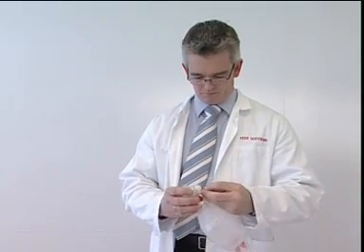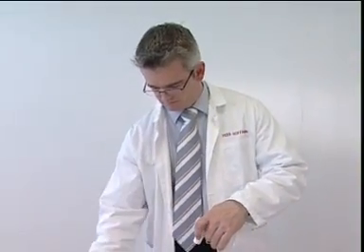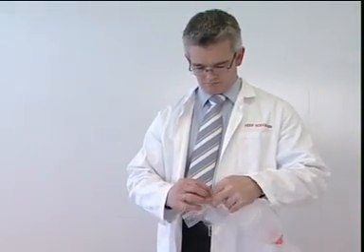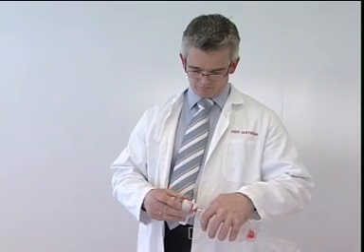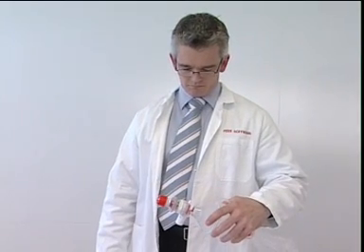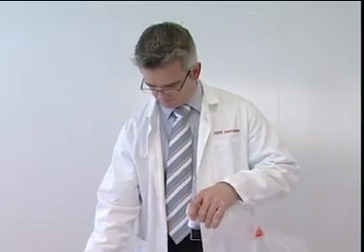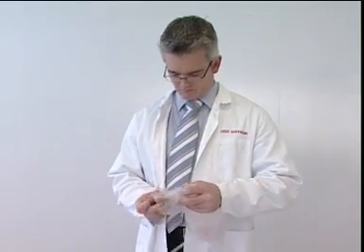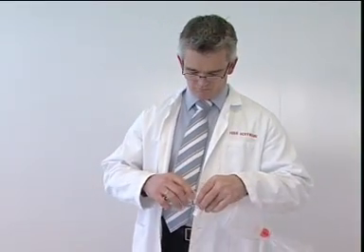The SPUR II can be used together with a PEEP valve to increase the expiration pressure. To use the PEEP valve, remove the splash guard and attach the PEEP valve to the expiratory connector. Attach the mask to the patient valve if the SPUR II is not intended for use with an endotracheal tube.